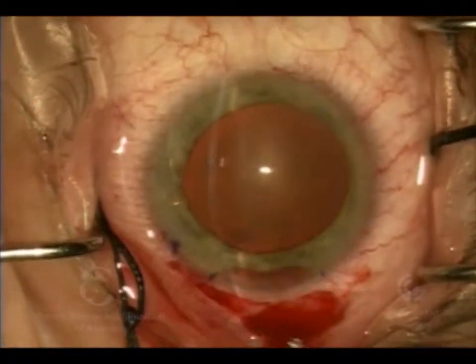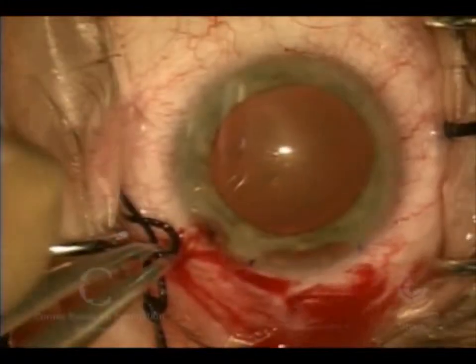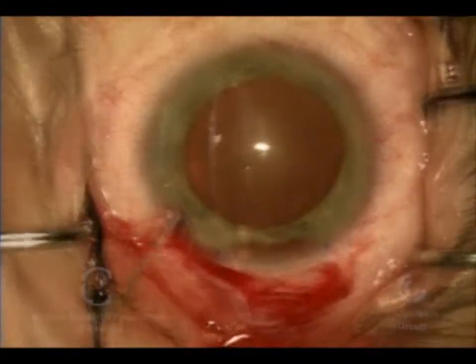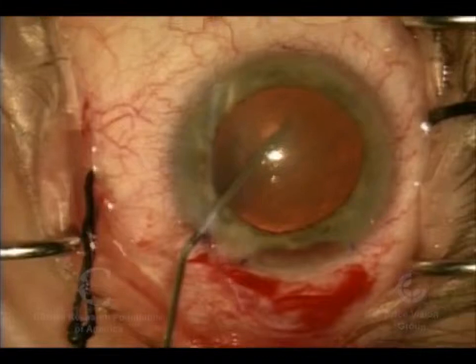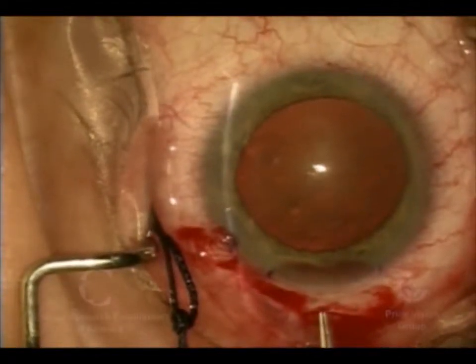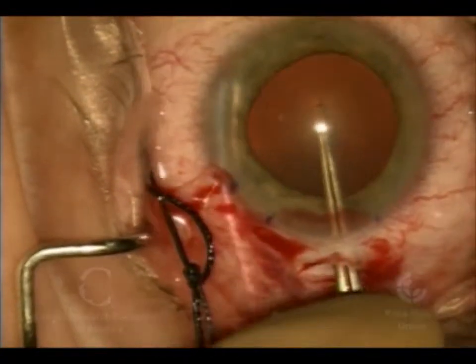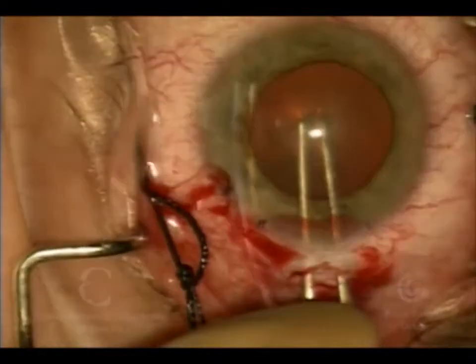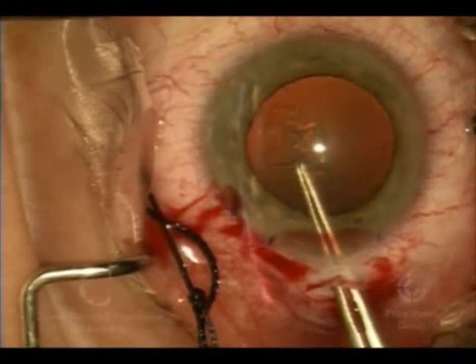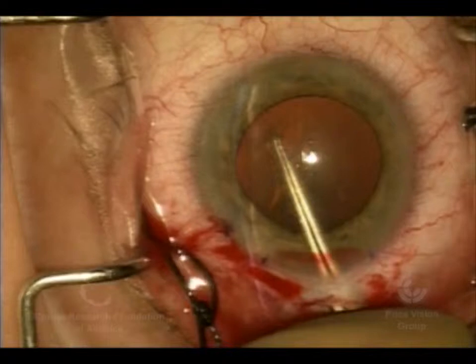We're now making a stab incision in the eye, which will facilitate our cataract surgery. We injected some anesthetic into the anterior chamber, then irrigated some viscoelastic — a gooey material that protects the back surface of the cornea and maintains the shape of the eye. We're going in to tear an opening, like a manhole cover, into the top of the capsule that surrounds the crystalline lens. When the lens becomes cloudy, it's called a cataract, and we're going to remove it before we fix the cornea.